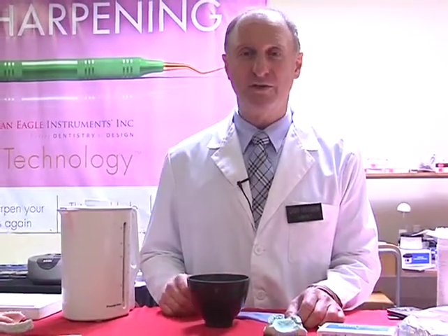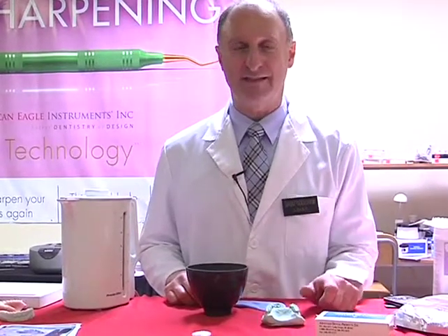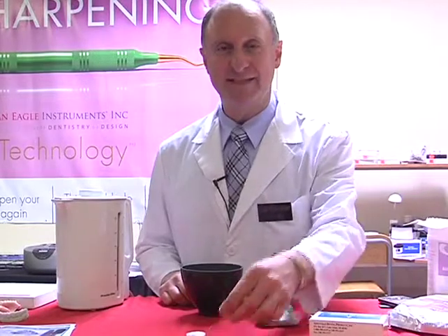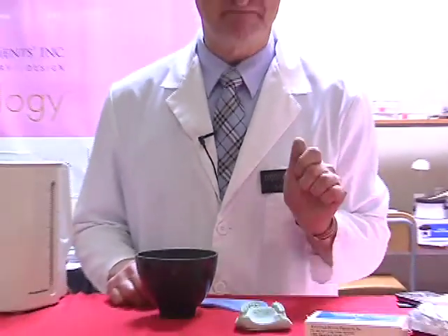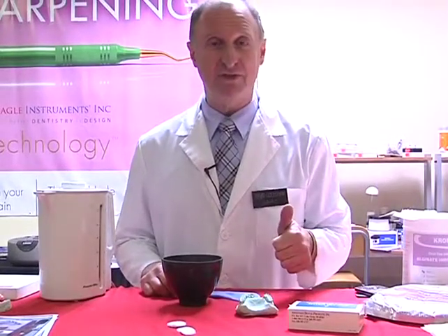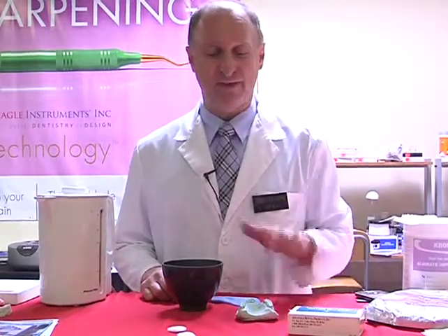I'm going to be showing you a material which is called the temporary crown matrix buttons, but we're going to be using this for a different purpose. This is a thermoplastic button. That means when we put it into hot water or apply heat to it, the material itself softens. We're going to use this to make a bleaching tray. So instead of making an impression, we don't need an impression tray, we don't need alginate, we don't need to model, we don't need to vacuum form, we're going to use this.